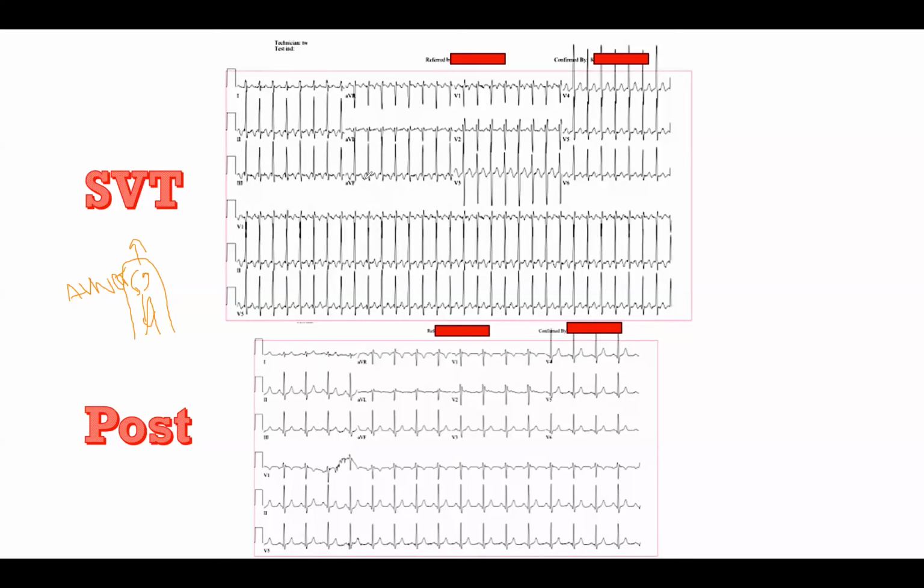We actually did a study a number of years ago in which we took the 12 lead EKG of children who had had ablations for SVT and whom we knew definitively what the mechanism was. And what we did was we cut the 12 lead EKG into 12 pieces. And then Leo Lieberman and I sat down and spent hours and hours trying to determine if we could guess what the mechanism was.